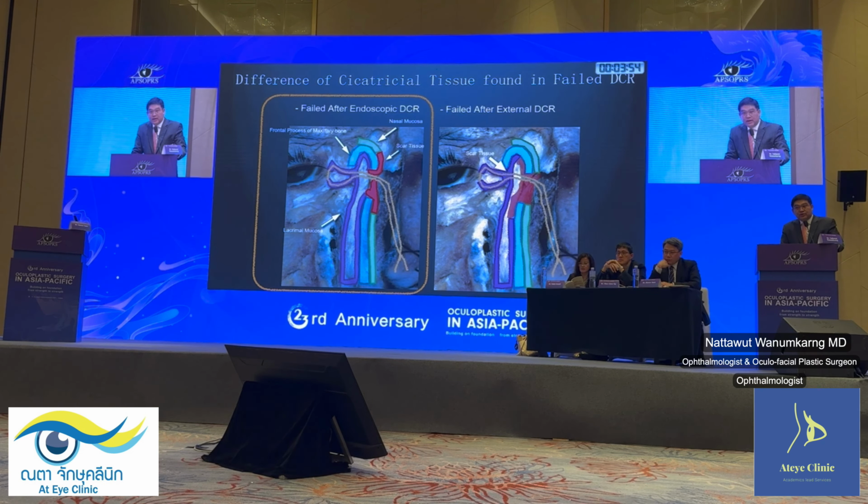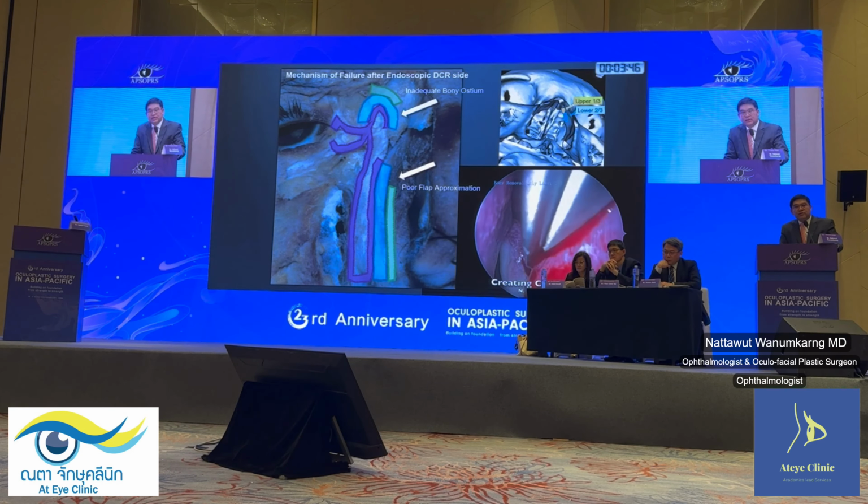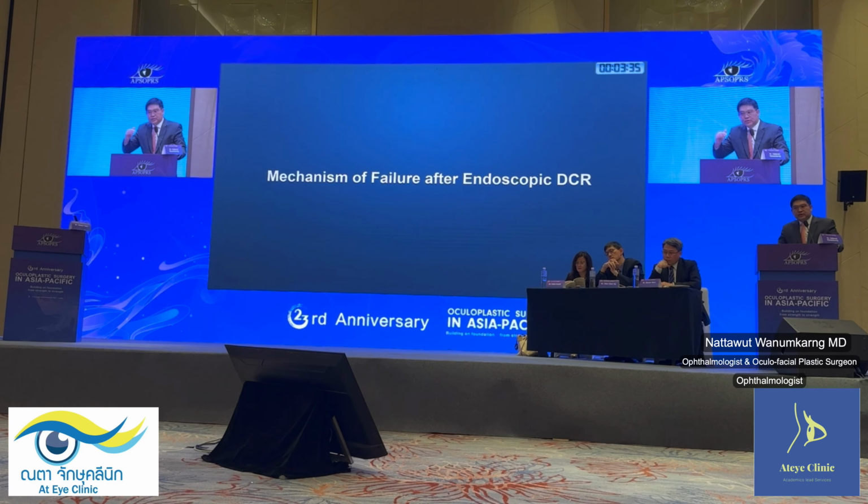The failures from the endoscopic DCR and from the external DCR. This one shows that the previous surgeon did not remove the upper one-third properly and disturbed the nasal mucosa too much. So they removed only the lower two-thirds and stopped.